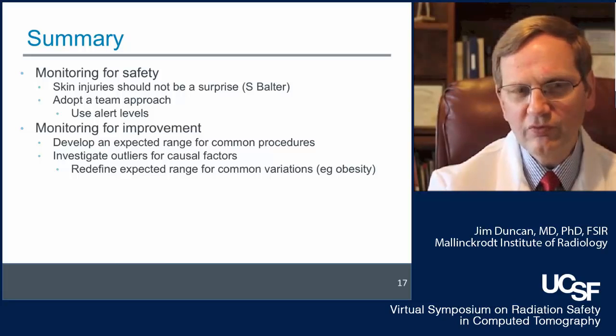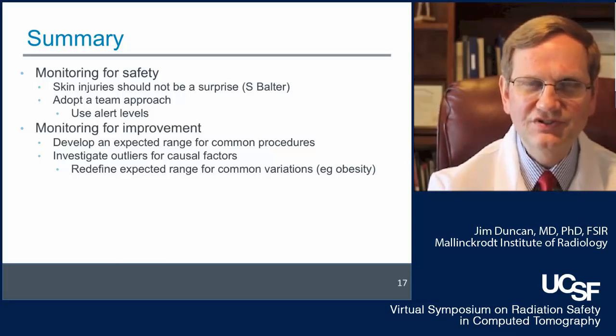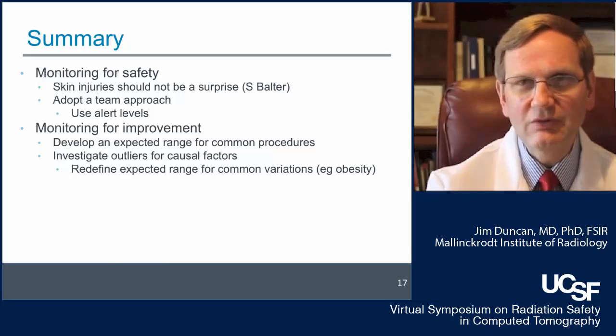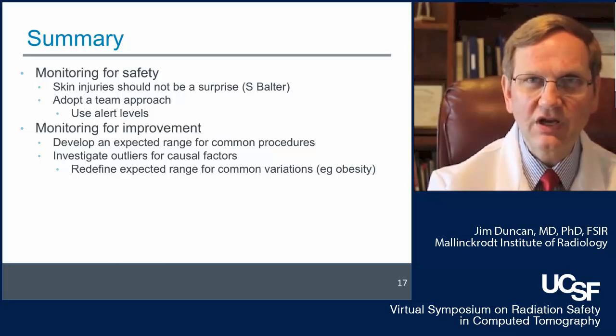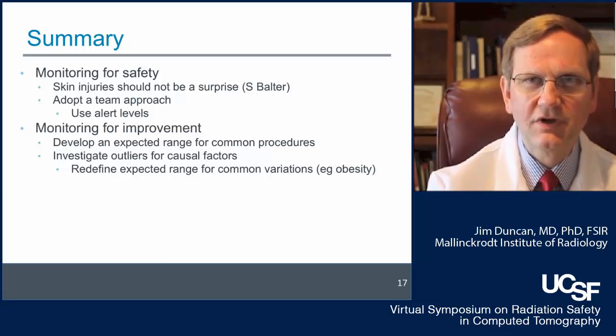Monitoring for improvement, we've started to develop an expected range for our common procedures and start to realize that when we look at outliers, we probably need a different expected range for certain classifications of patients, such as the very large. Thanks.